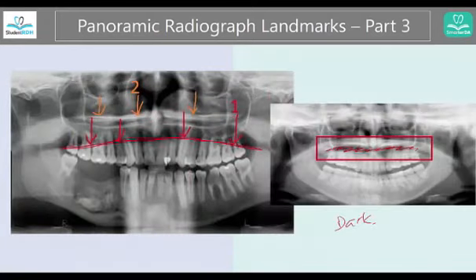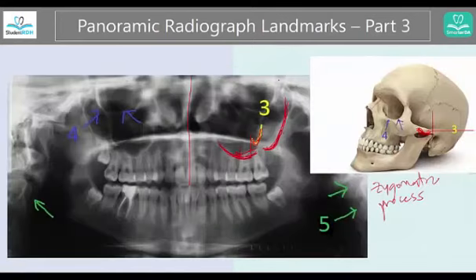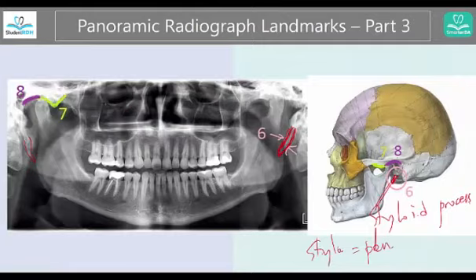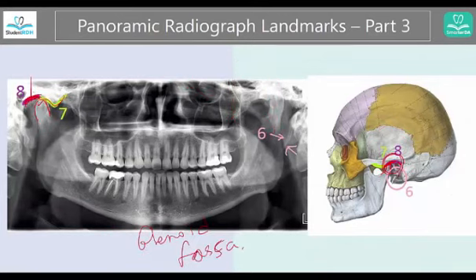Let me recap quickly. Number one: the dark area — the border of the tongue. Number two: the hard palate, which looks radiopaque. Number three: the U-shaped radiopaque area called the zygomatic process. Number four: the bottom of the orbits. Number five: the spine. Number six: the pointy area called the styloid process. Number seven: the little bump called the articular eminence. Number eight: the area that fits with the condyle, called the glenoid fossa. I hope this all makes sense. We've reviewed parts one, two, and three. If you haven't watched them, just go back — it takes five minutes and you will know everything about panoramic radiograph landmarks. Thank you.